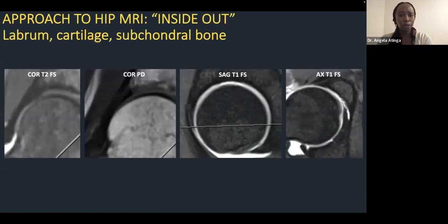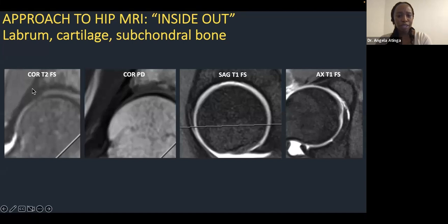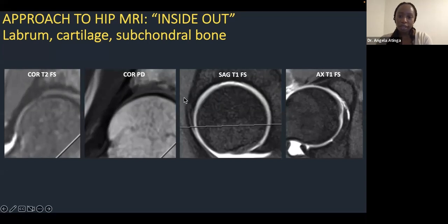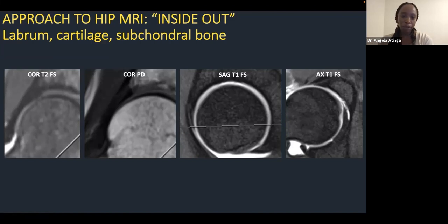Reviewing normal anatomy: here are zoomed-in images of two hips — screen left from a routine 3T MRI, screen right from an arthrogram. On coronal images the part of the labrum visible is often called the supralateral labrum. On both T2, PD, and T1 images you want to see a relatively dark, triangular structure. It's T1 dark and T2 dark, same on T1 fat-sat arthrogram images. You want to see a dark labrum maintaining that triangular shape, though there is some variation in shape.